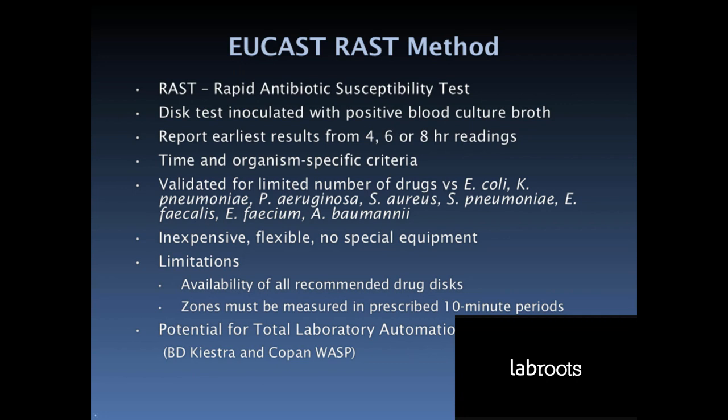Overall, the potential of this test is impressive. It provides the rapid and accurate detection of resistance and susceptibility that is urgently needed for the main bloodstream pathogens. This test is definitely worth considering as an addition to the workup performed directly on a positive blood culture.